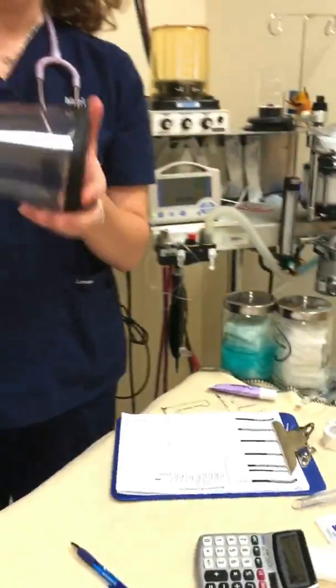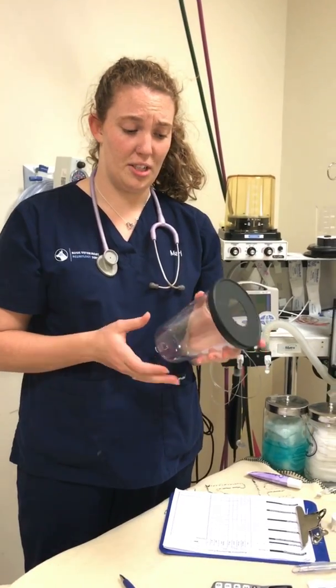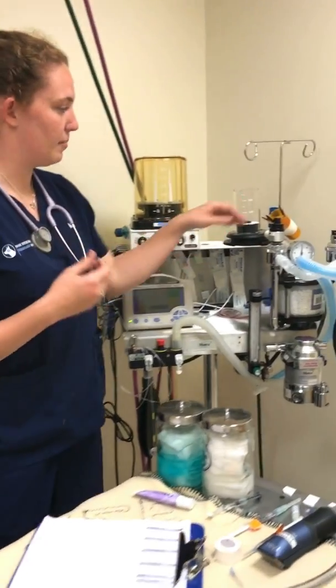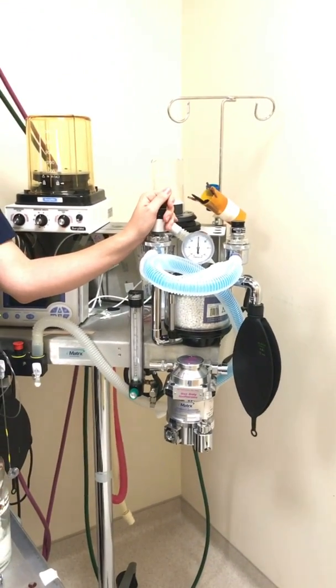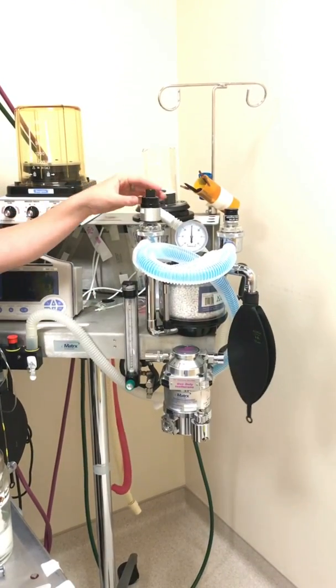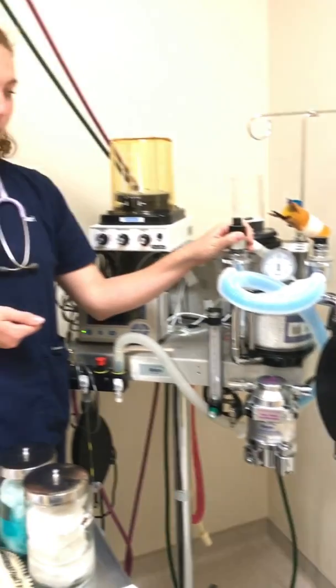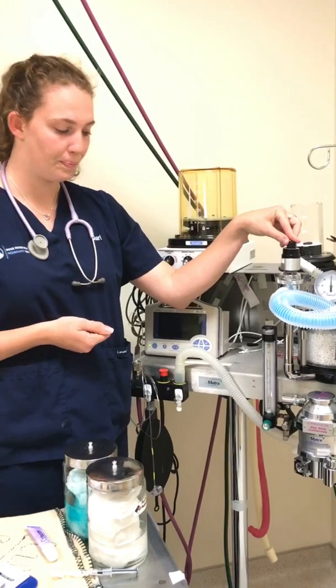Also got my induction mask here to supply her oxygen prior to as well as during her induction. I've got my oxygen machine here that has already been appropriately leak tested and set up for Kinsey's size with a 2-liter rebreathing bag or reservoir bag. It has also been set up with a semi-closed rebreathing system with our pop-off valve halfway open.